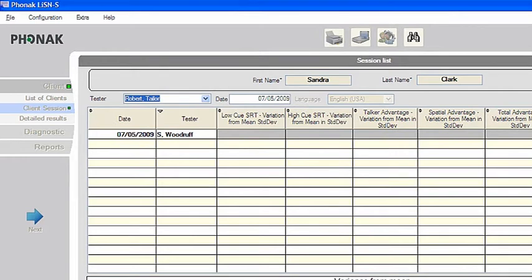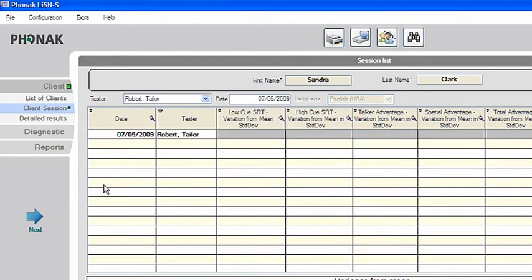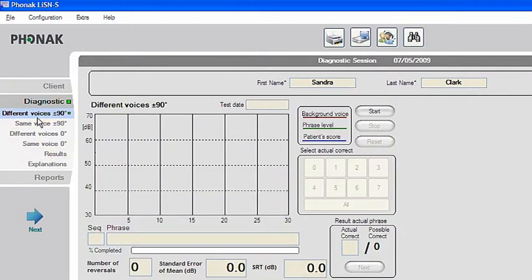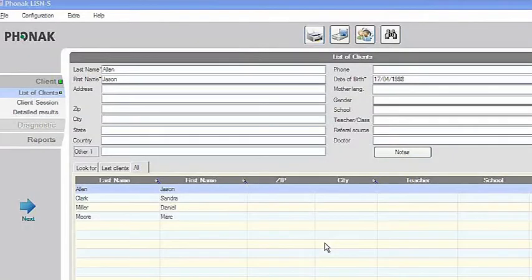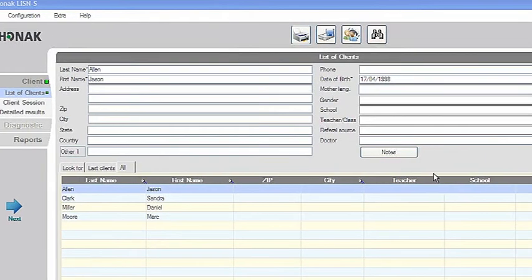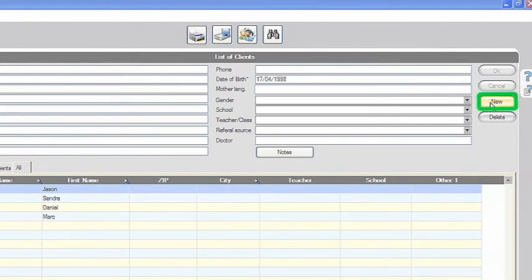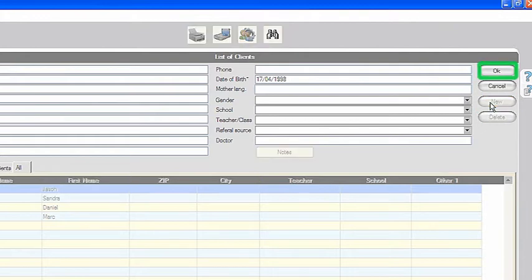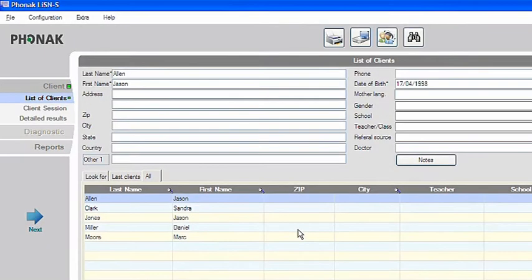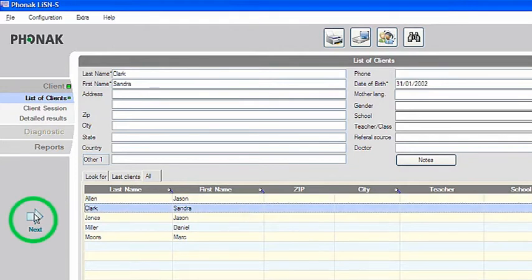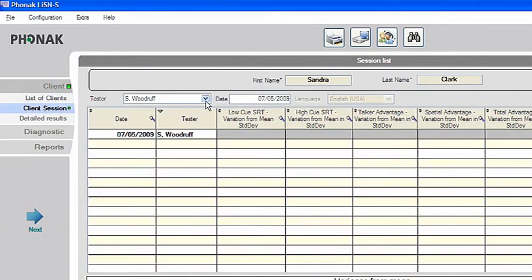It may be that Listen S was administered before, so all previous session details can be viewed here. If the client is new, or if Listen S needs to be re-administered to an existing client, select New and OK on the right of the screen and a new session will be added. You are now ready to start the diagnostic test.